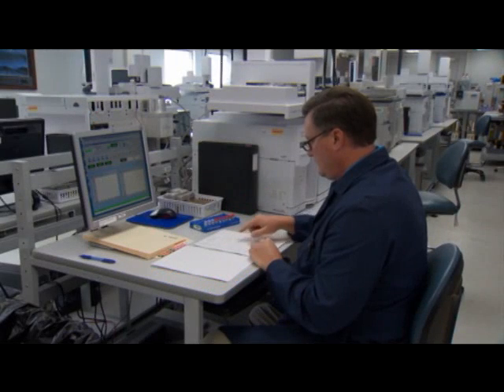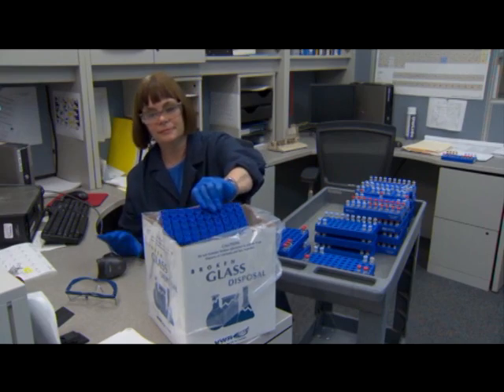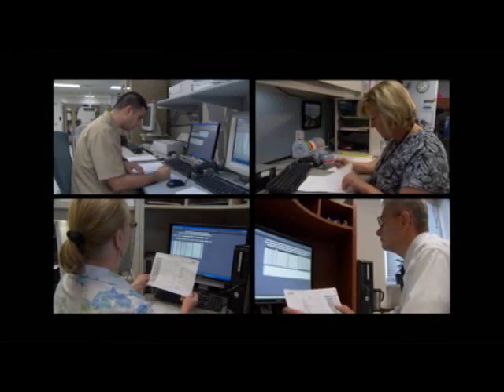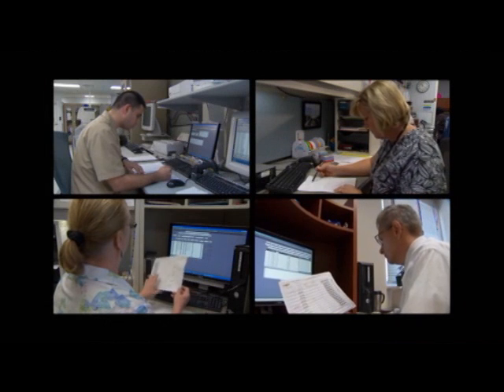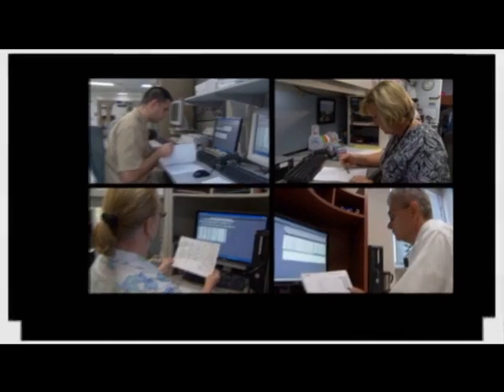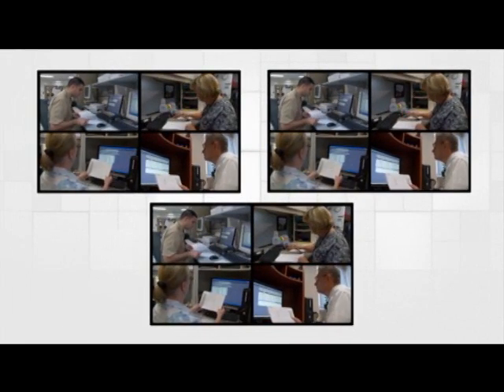If the specimen tests negative, the service member's specimen is deemed negative and discarded. If it tests positive for a 3rd time, the results are once again validated through 4 levels of review. This means that every confirmed positive test result is reviewed for accuracy a minimum of 12 times before it is sent to the service member's commanding officer.